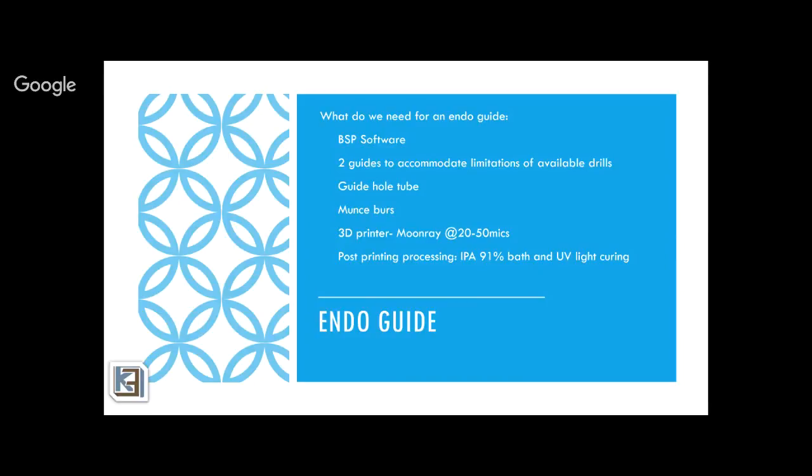Once we had that freedom with BSP, I was able to create guides for endo, and I was able to clinically use and test it on my patients, and it proved to be extremely accurate and amazing. It's been a great 3 years learning experience for me, and it's been a blessing and a change in my practice. So you would definitely need Blue Sky Plan as a software.